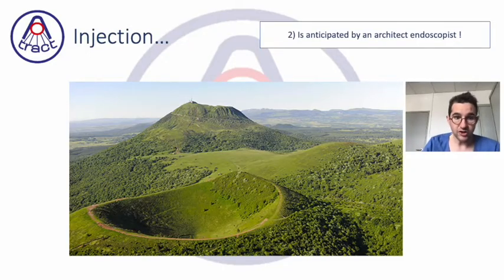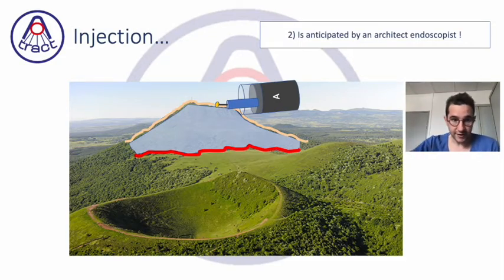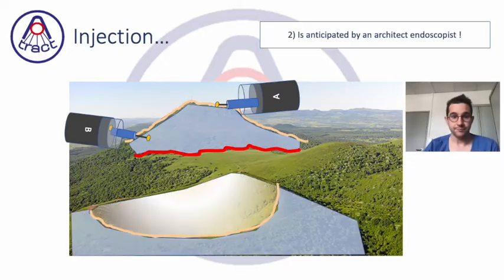What you want to reach is something which is facing you with a mountain face, because if you are at the top of the mountain on the plate, you have a tangential approach, and the knife cannot enter into the submucosa very easily. But if you are facing the mountain face, the mountain elevation, you will be more effective with a deeper cut.